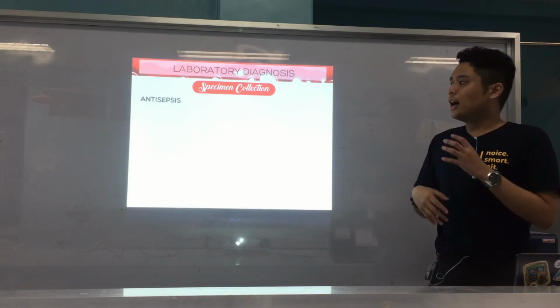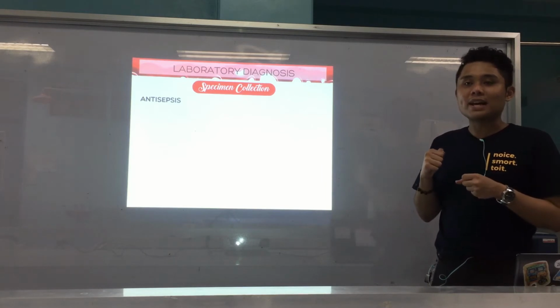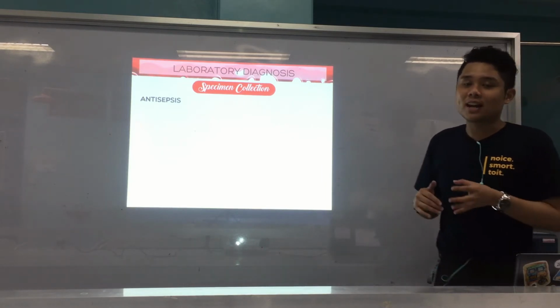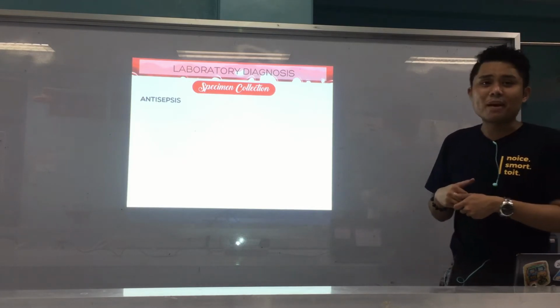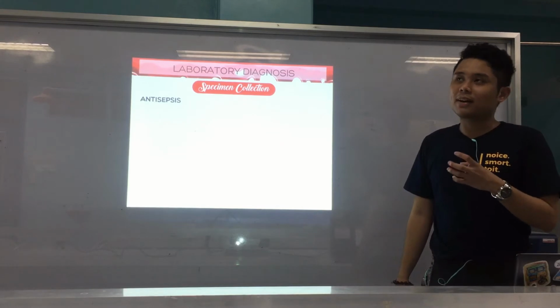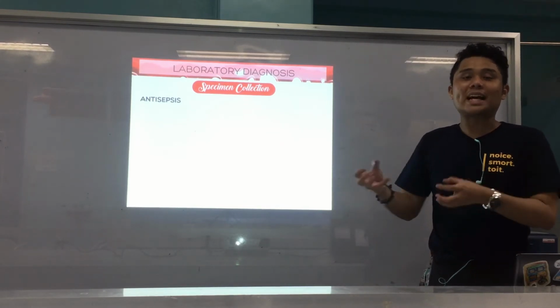All right, so we now follow antisepsis. Our goal is to really limit and avoid as much as possible external contamination of our specimen, knowing that blood is very precious and very critical.